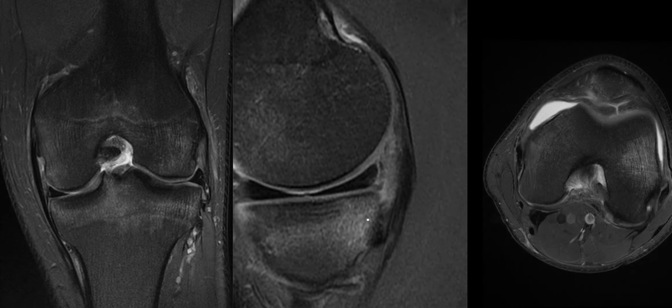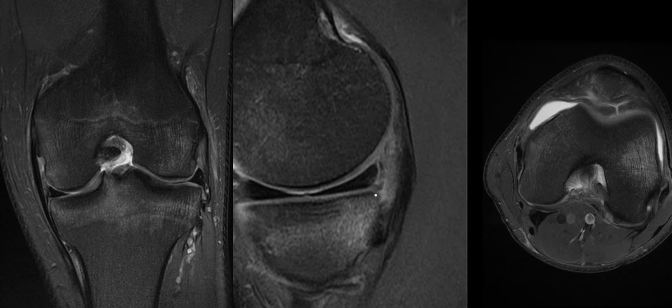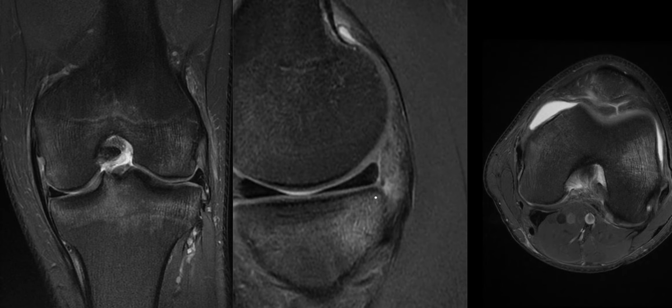But because the bulk of the meniscus looks normal, it's easy to overlook. These injuries do lie within the so-called red zone or vascularized portion of the meniscus, so they may heal themselves, but they can also be unstable and require treatment. These lesions are also sometimes referred to as ramp lesions.